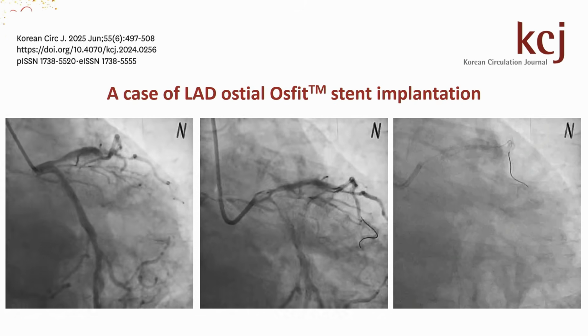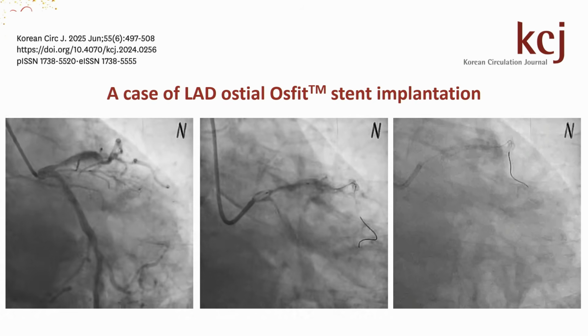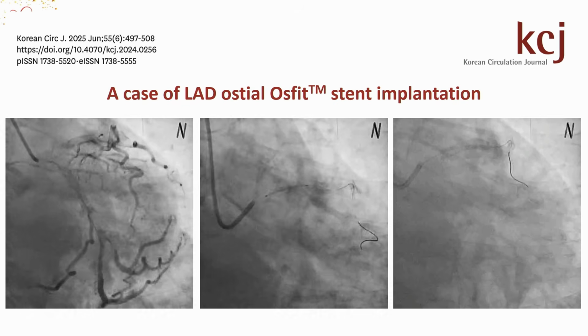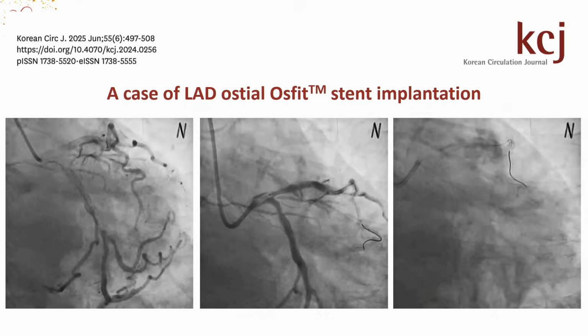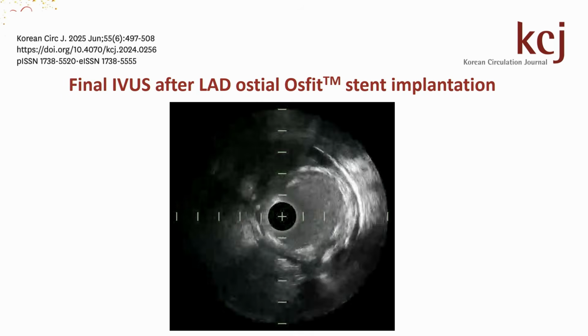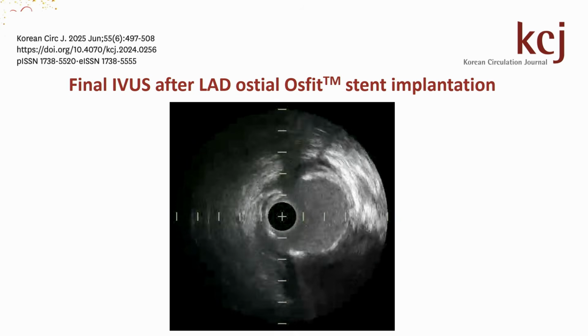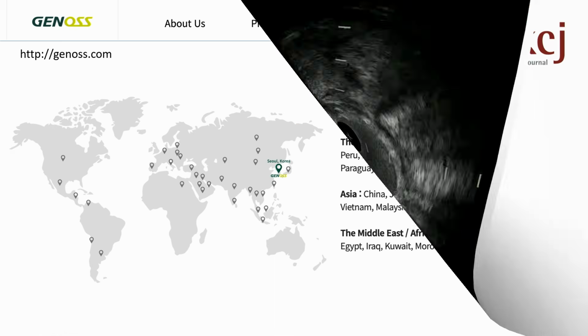You see the balloon in the left main, the operator is pushing the balloon, and this is after delivery of the stent. And this is the IVUS demonstrating the position, perfect position at the ostium.